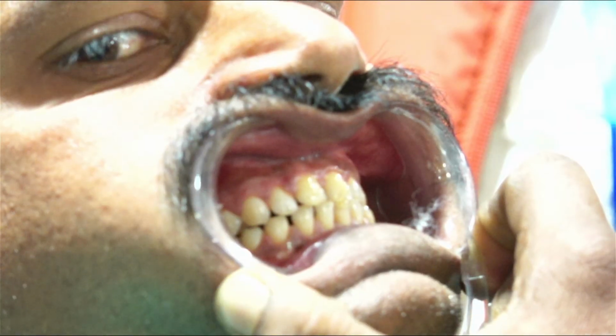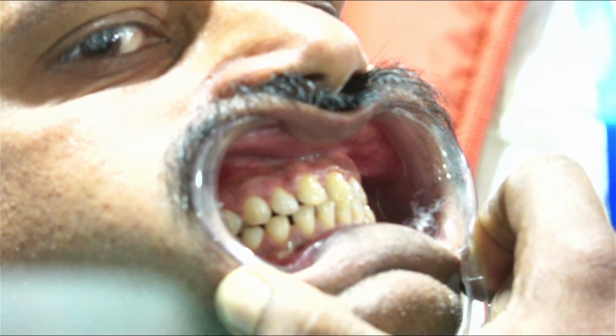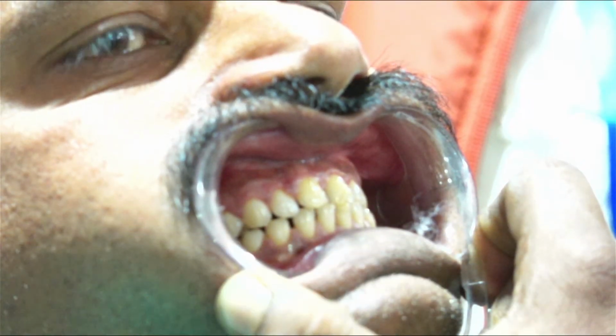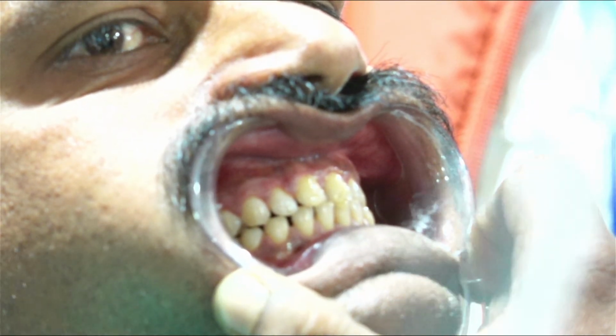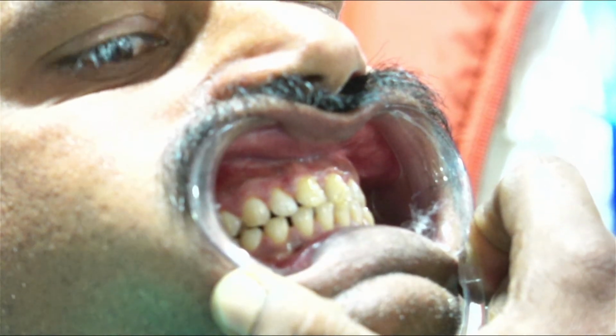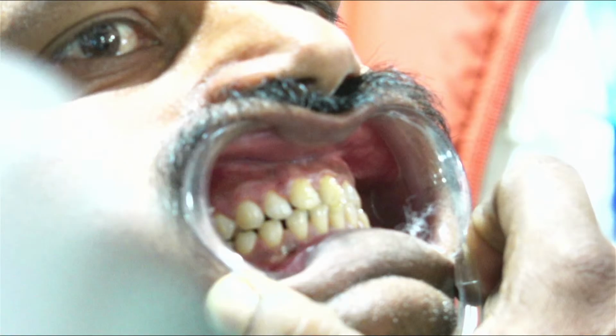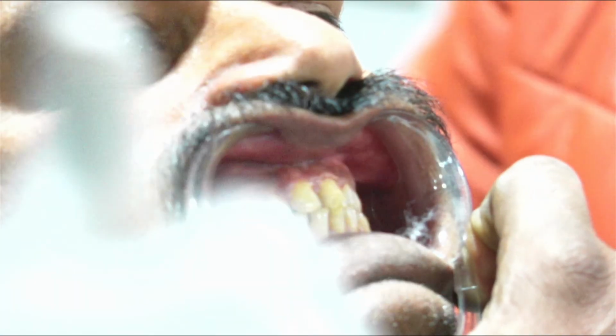See the way I'm talking to you, my laser is always covered. I'm not going to point it like this and show you. So this, no, cotton is also there. And these lasers are so powerful. Whenever the patient has a fracture, if you put it on a plaster, they will penetrate the plaster. So just to make you aware how powerful the lasers are, be very careful.